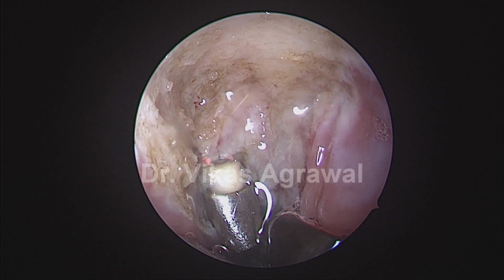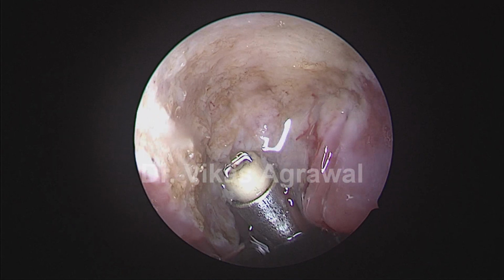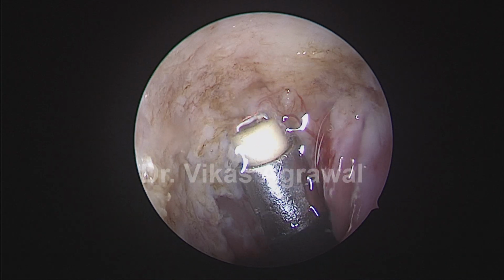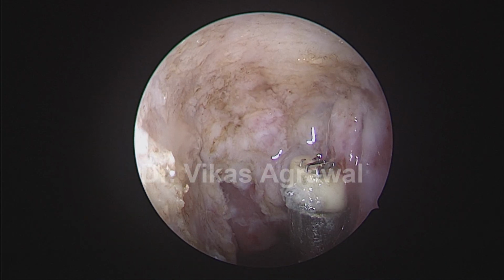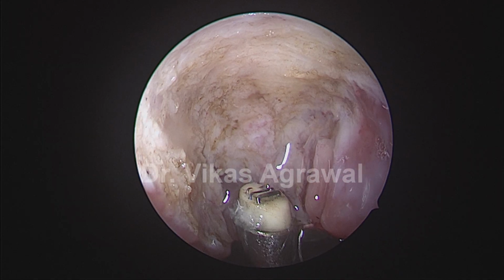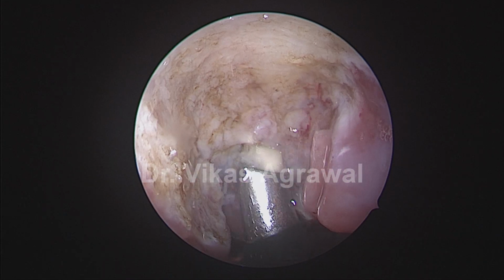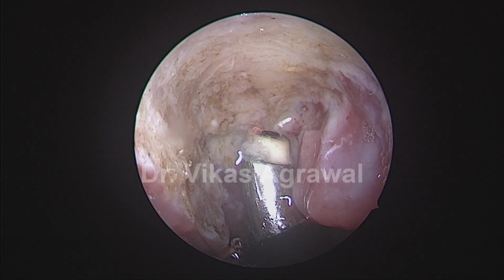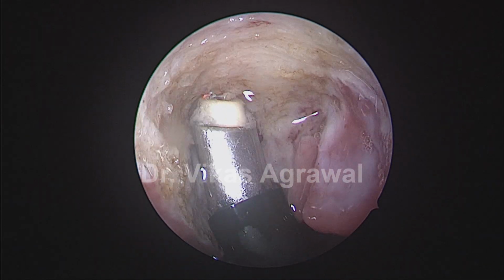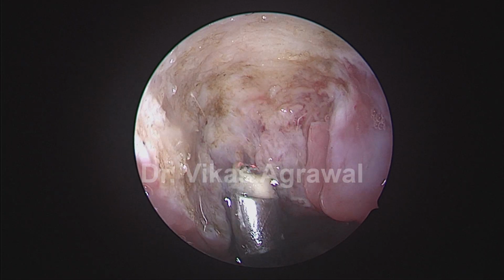Now I am in the extreme posterior aspect. That's the fossa of Rosenmuller. I am removing tissues from the fossa of Rosenmuller. Let me just stop this bleeding over here. And very soon I'll show you the fossa of Rosenmuller and the buccopharyngeal fascia very clearly, which is the posterior boundary.